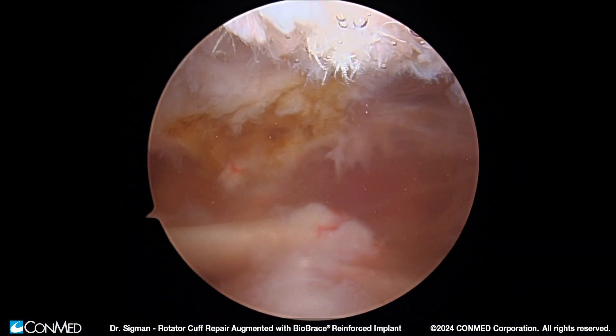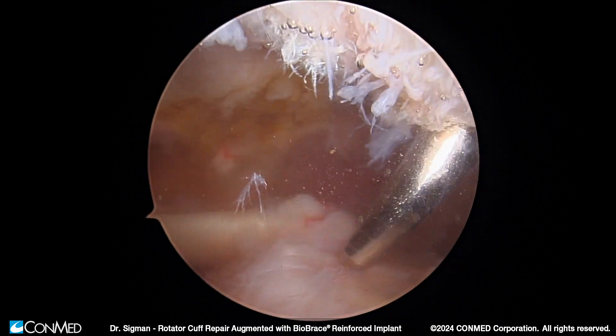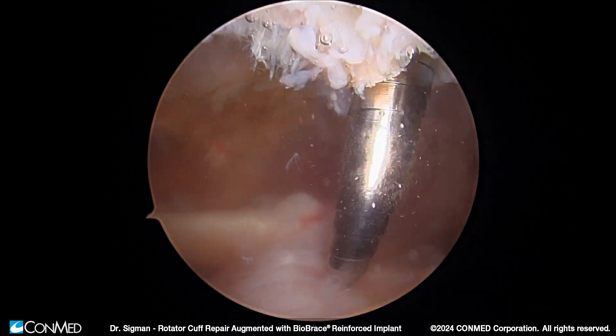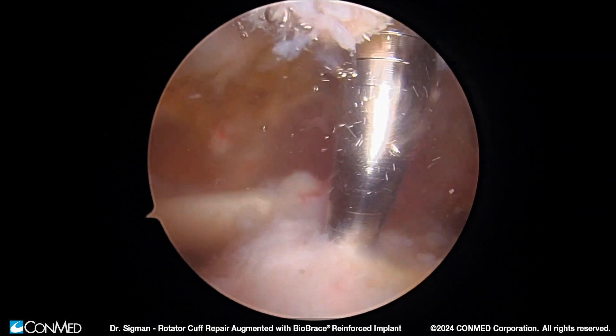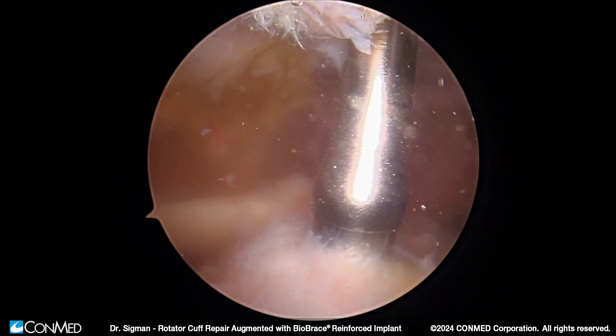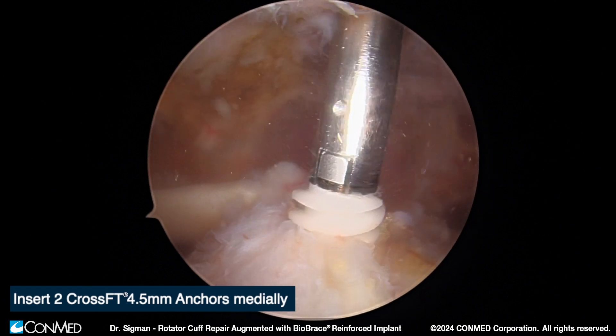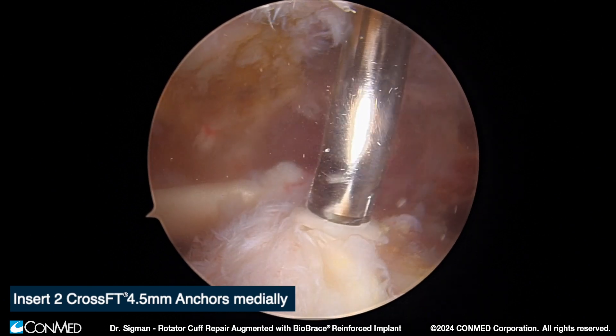As you can see here, we're looking from the posterior aspect of the shoulder. This is in a lateral decubitus position. It's a large type 2 degenerative tear pattern in a right shoulder. You can see the biceps is intact here, and we are now placing our CrossFT 4.5 anchors medially.